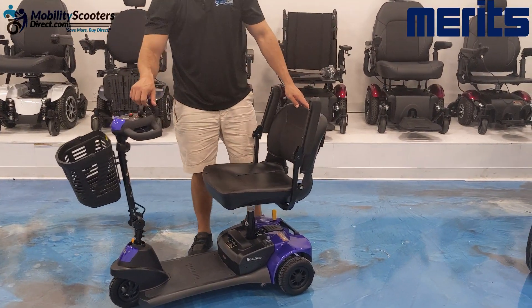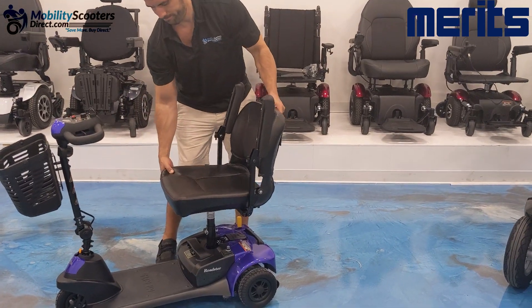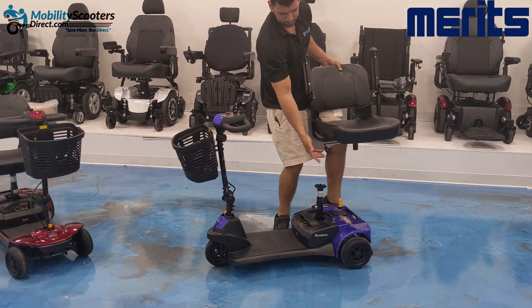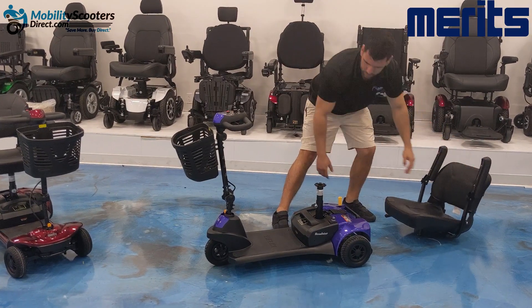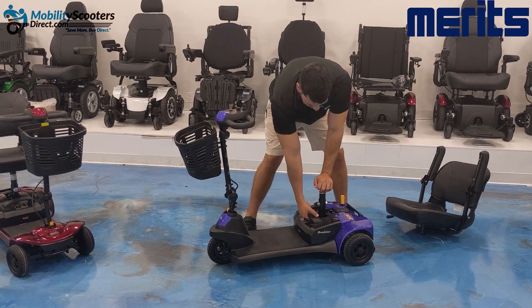The chair is easily removable — simply pick straight up. The battery is also easily removable: grab it by the handle, firmly lift up, and it will disconnect from the base.